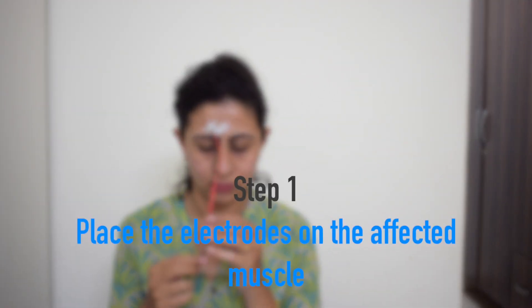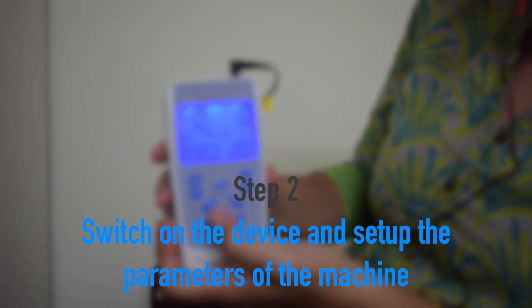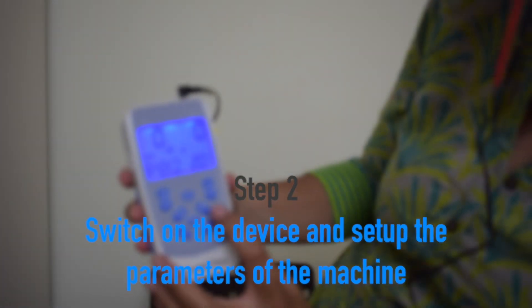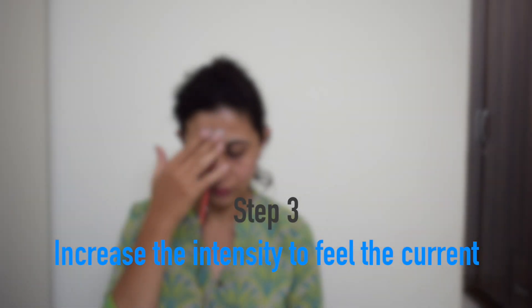Step 1 is to apply the electrodes over the area of the muscles that are being affected. Then switch on the device and set up the parameters. Once you have set the machine in EMS mode, you will start feeling the contraction on the affected muscles.